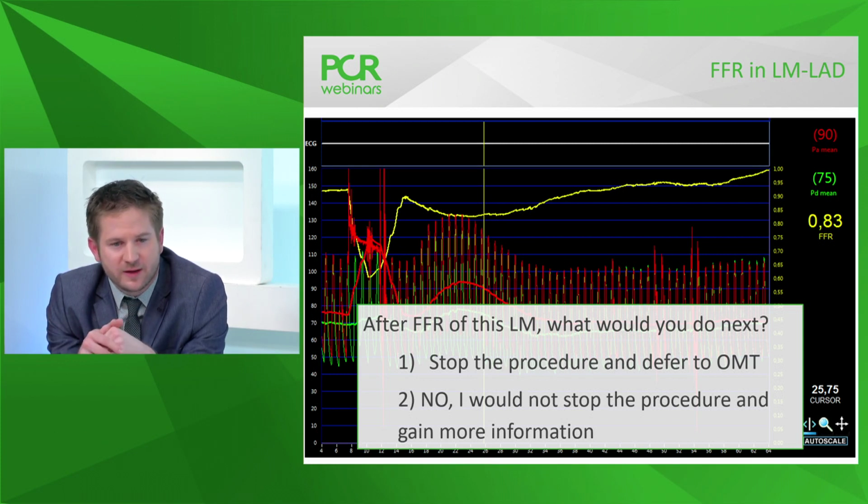But may I also ask, how did you perform the FFR measurement? Did you use intracoronary adenosine or IV adenosine? It's quite often a question that we receive. Well, it's an important one. In this specific case, we did a very quick assessment with IC adenosine. I gave 2 IC boluses, and having a preserved fractional flow reserve value in both situations made me happy with this assessment.